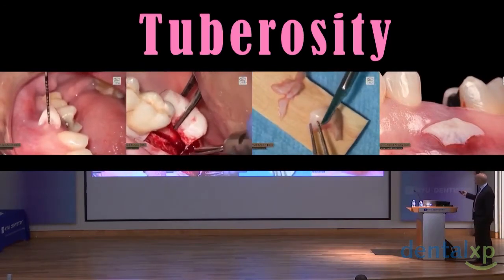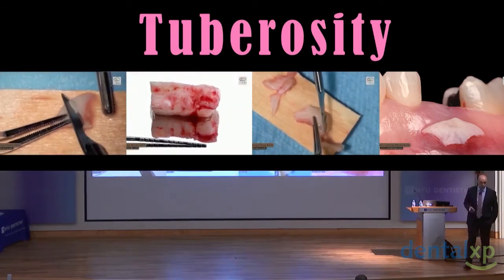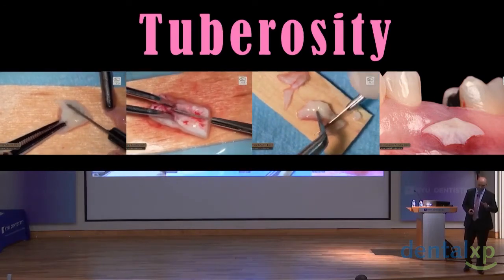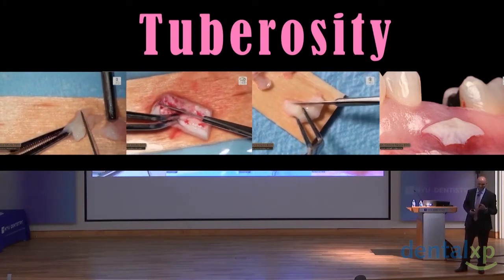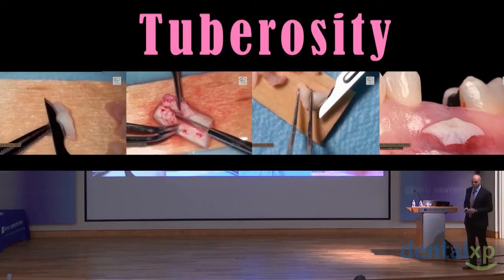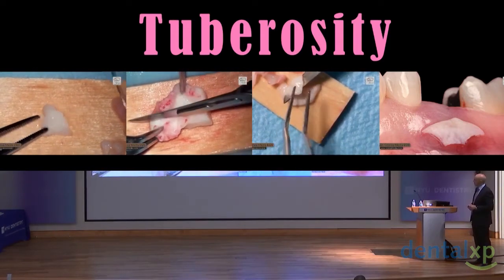And this is a very thin soft tissue graft, very thin. You see that. Summarizing what I always do, of course, is to take out the epithelium. And not only that, you said that before, we shouldn't place those thick grafts directly on the site. It's better to thin the graft before placing it. I agree with you, absolutely agree with you.